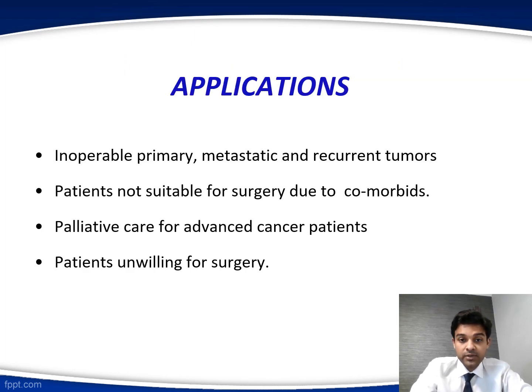Let us see now about the applications for various ablations. So the applications are as follows: inoperable primary, metastatic and recurrent tumors, patients not suitable for surgery due to comorbids, palliative care for advanced cancer patients, patients unwilling for surgery.